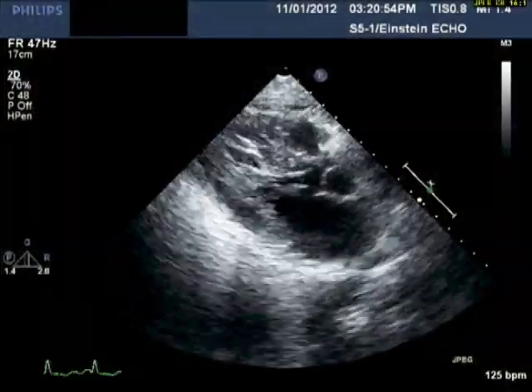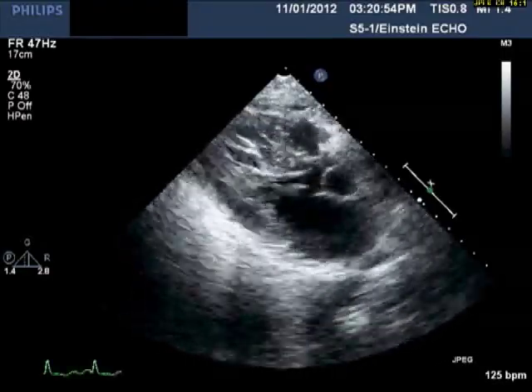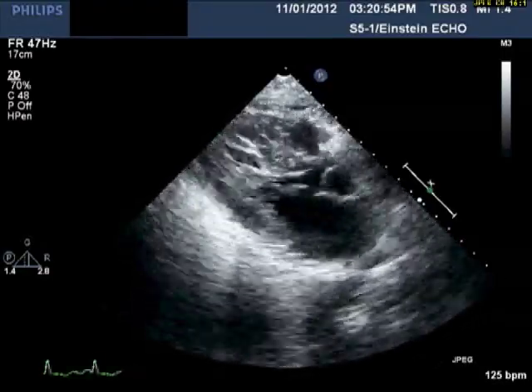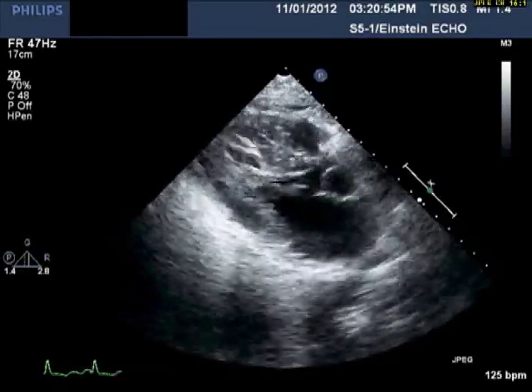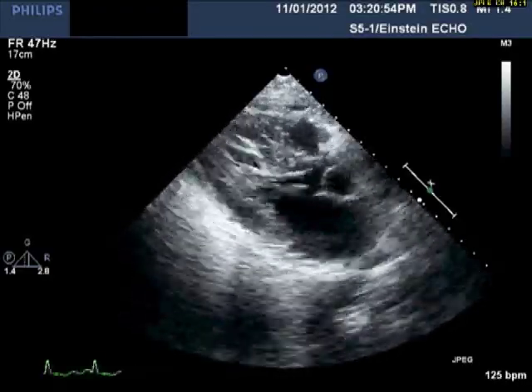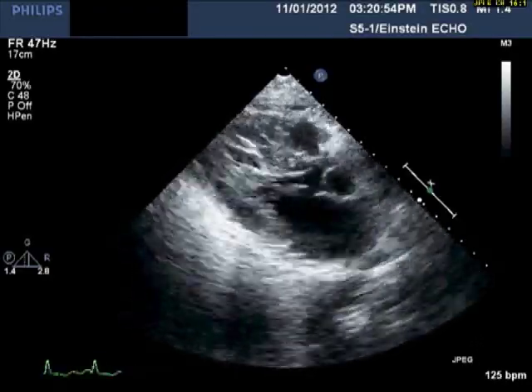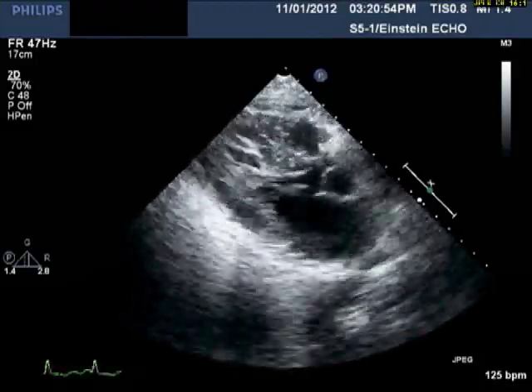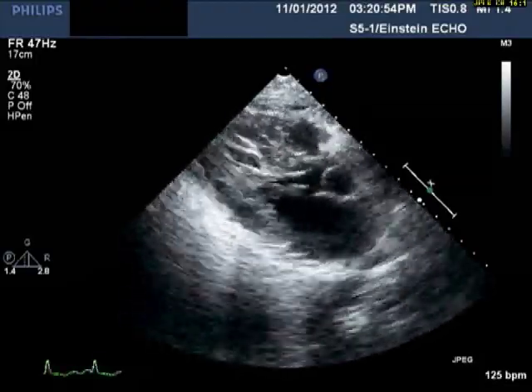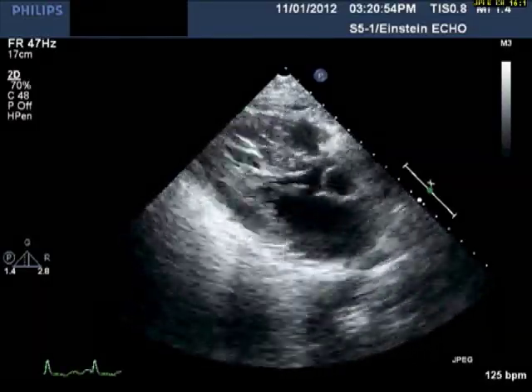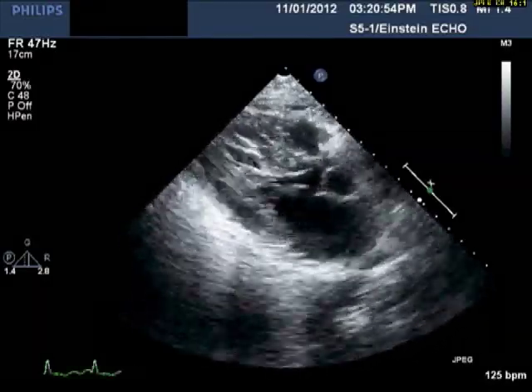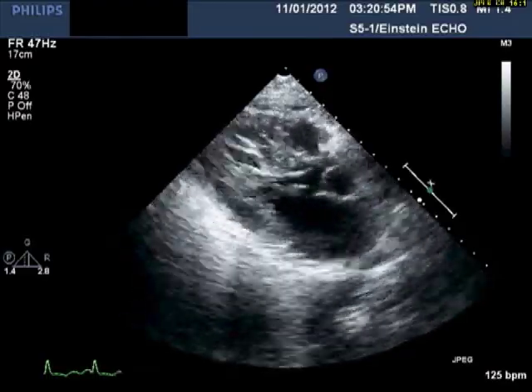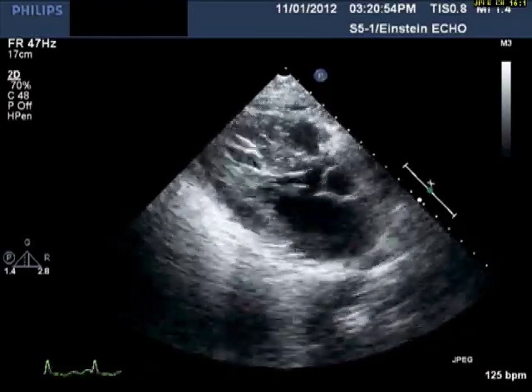You can see in the parasternal long axis a heart that is going rather rapidly. It looks hyperdynamic and the chamber sizes appear to be normal.